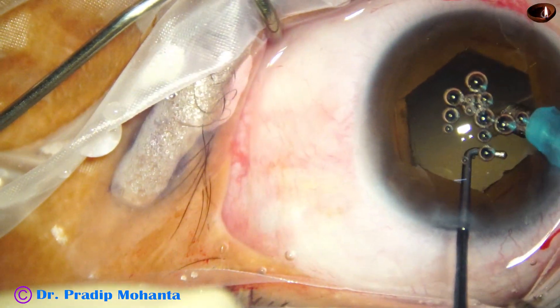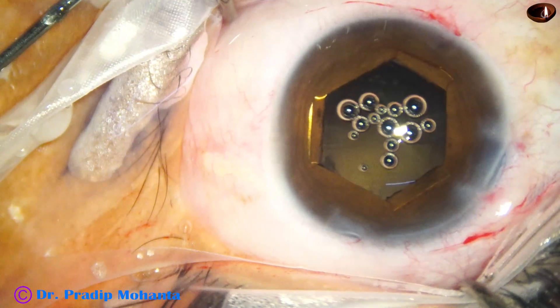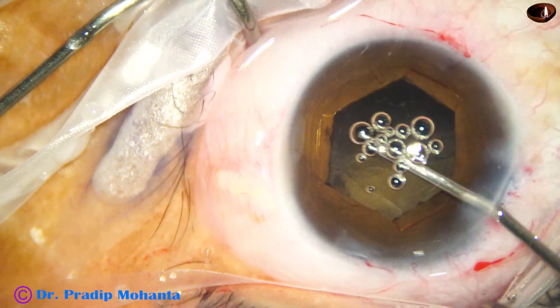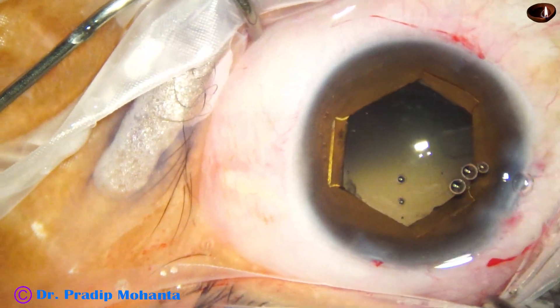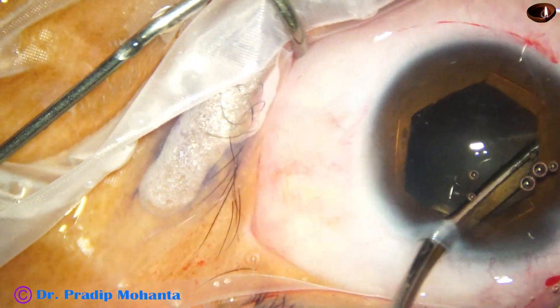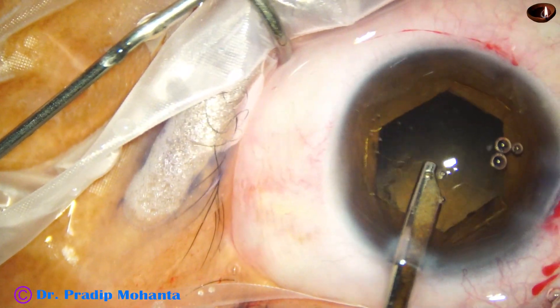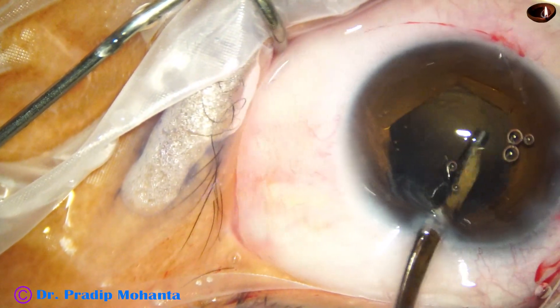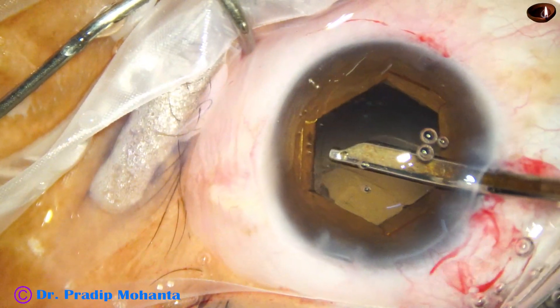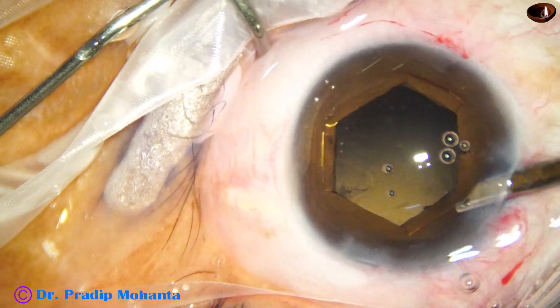There are some cavitation bubbles. And now some cortex is remaining. Inject air bubble. And I am going to use a 23-gauge Simcoe cannula to remove the cortex, going through the main wound and removing these cortical fibers. And cortical cleanup is done.